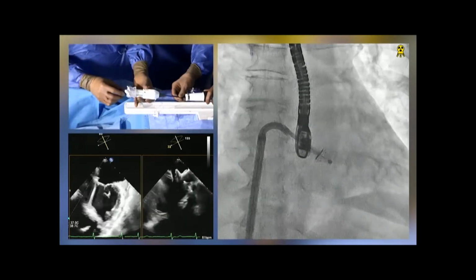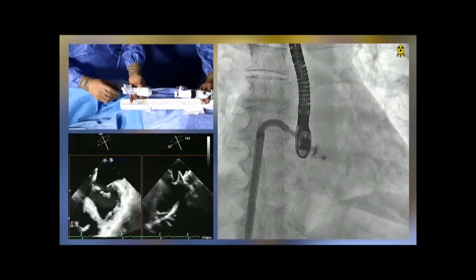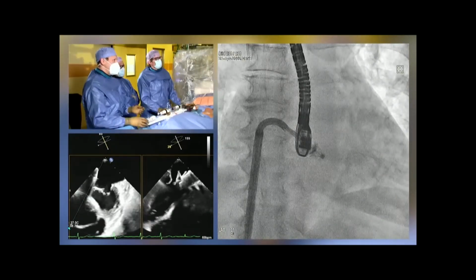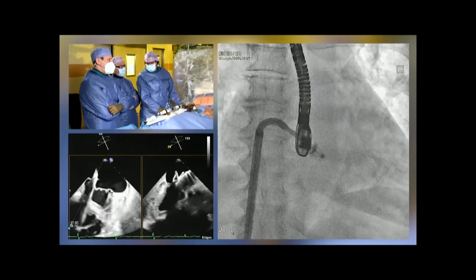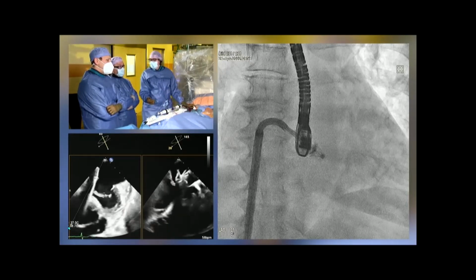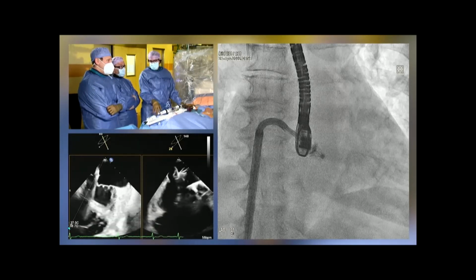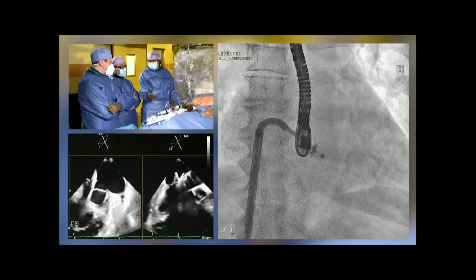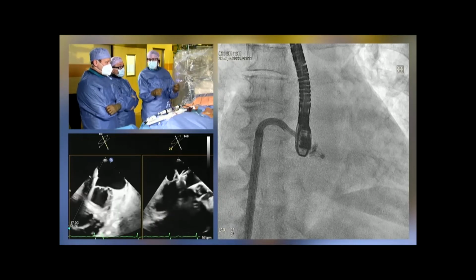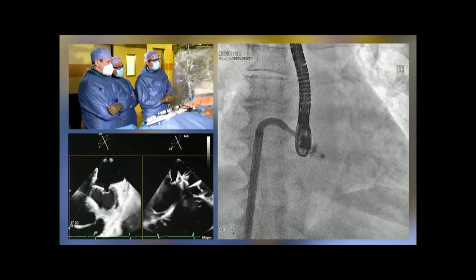How often are you doing independent grasping as the first grasp with this device? Yeah, so we go for simultaneous grasping unless independent is really needed. But what we almost always use is the so-called single leaflet optimization maneuver, meaning that the first grasp is simultaneous, but then we optimize one or the other leaflet by doing it independently.